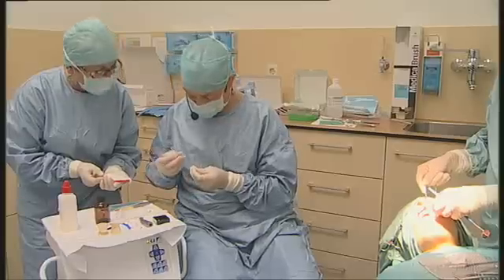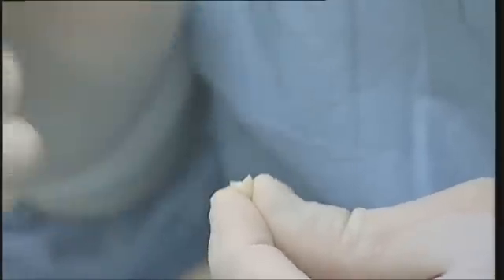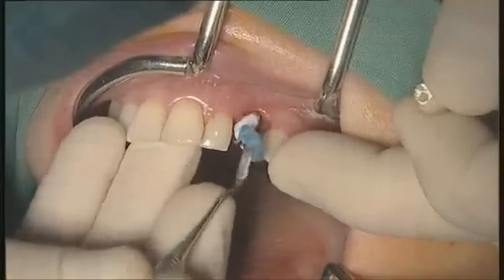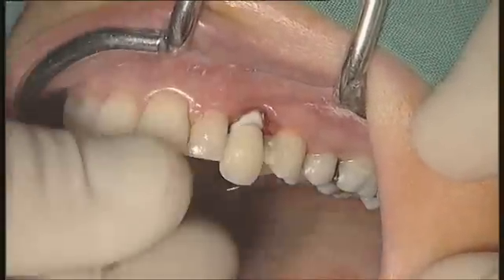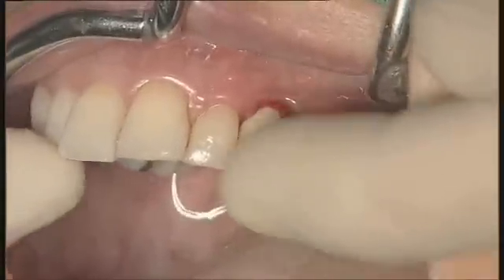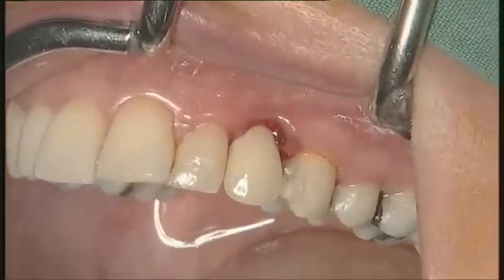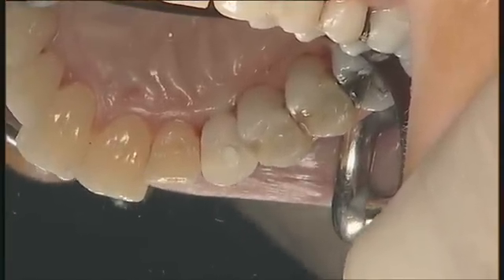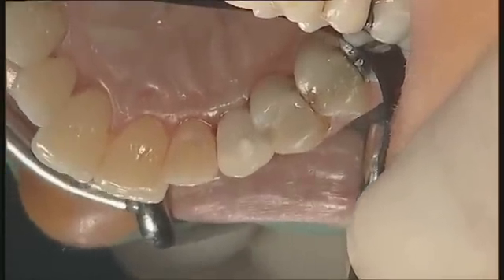Now we are going to cement the crown. I will use a very limited amount of cementation material. The crown is now seated. You can see the excess cementation material that has gone out from the vent hole on the palatal aspect.